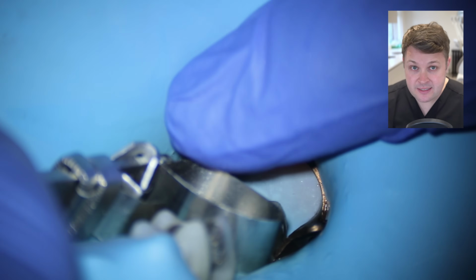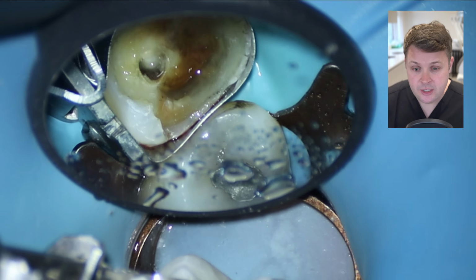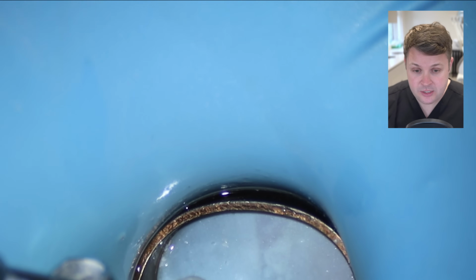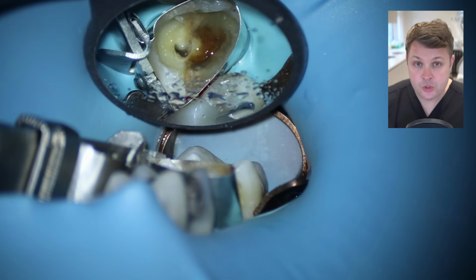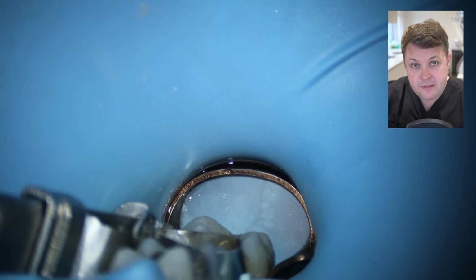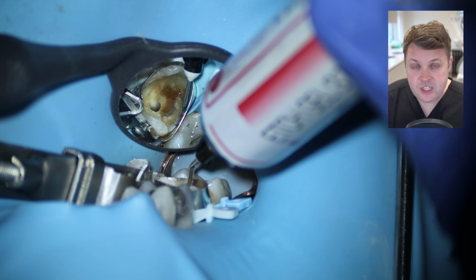Of course, I've got the mesial distal aspect of this tooth, so there's a poor adaptation you can see here. So I'm just going to place some wedges just to make sure the matrix band is adapting nicely to the margins of the tooth, and also it's going to wedge it out slightly. So when you place the composite filling and you remove the wedges, the contact points between the filling and the teeth are all nice. We're then going to do some selective etching here.